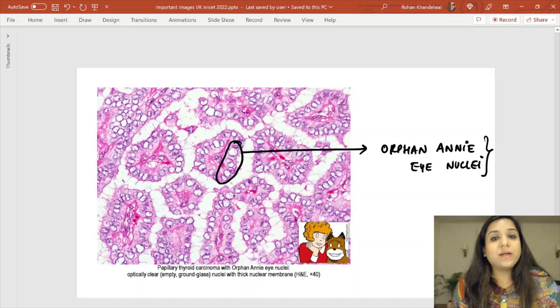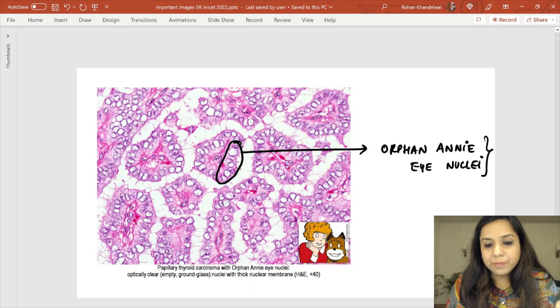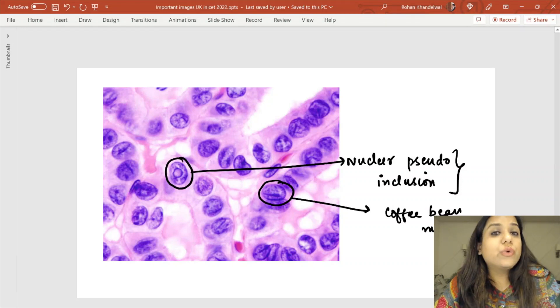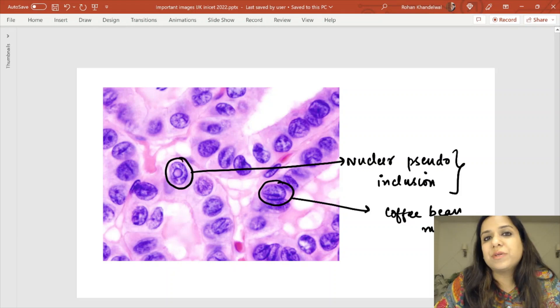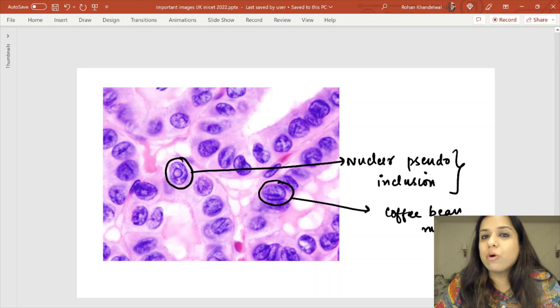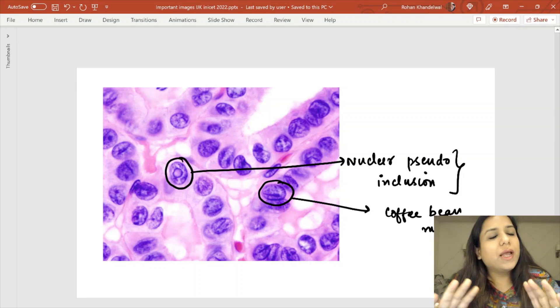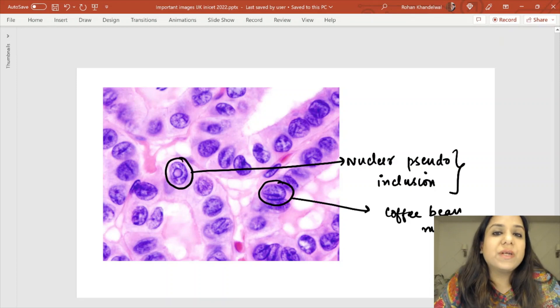Five important microscopic features of papillary carcinoma of thyroid: papillae, orphan Annie eye nuclei, nuclear pseudo-inclusions, coffee bean nuclei, and psammoma bodies. You can see the longitudinal grooves and nuclear pseudo-inclusions clearly in the image. Anything related to thyroid cancers is extremely important — please remember all five features.